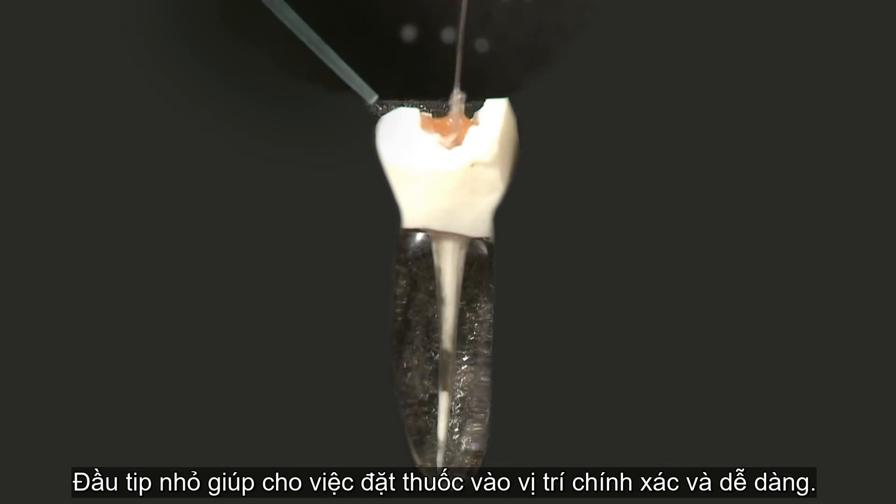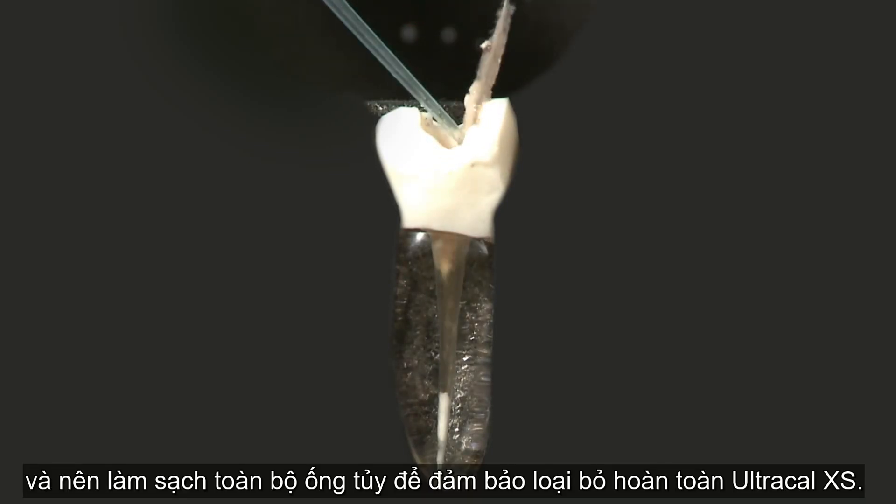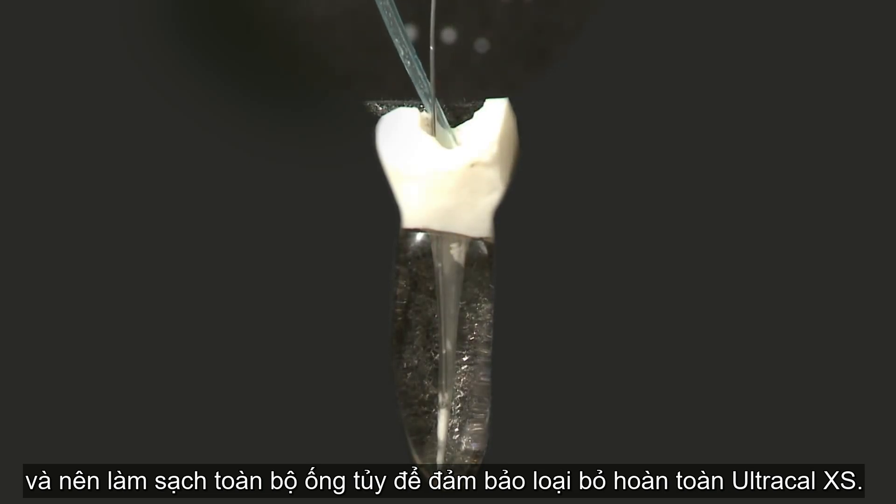This small tip delivers the chemistry where it is needed and also scrubs the sides of the canal to assure complete removal.